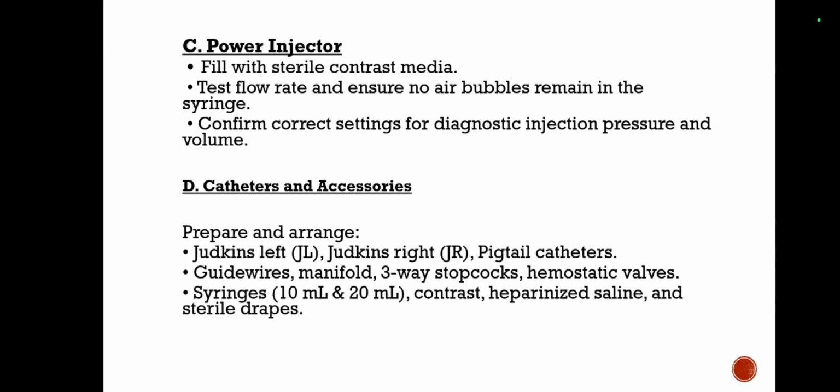Next is the power injector. If a procedure needs this power injector, we have to fill the power injector with the sterile contrast media. Next we have to test the flow rate and ensure no air bubbles remain in the syringe. Confirm correct settings for diagnostic injection pressure and volume.